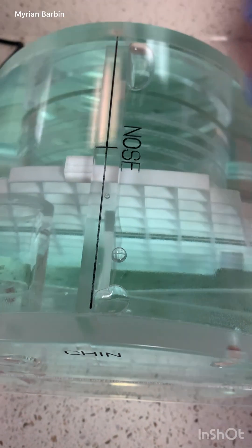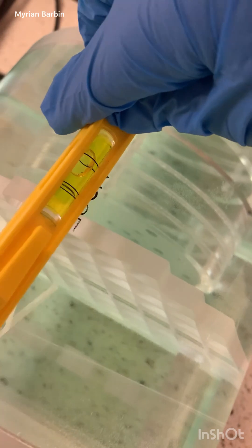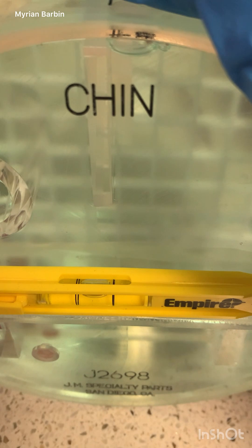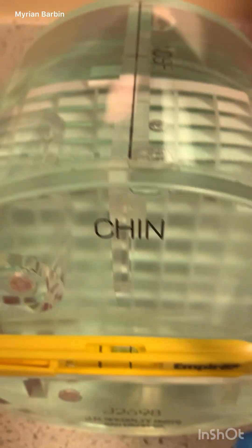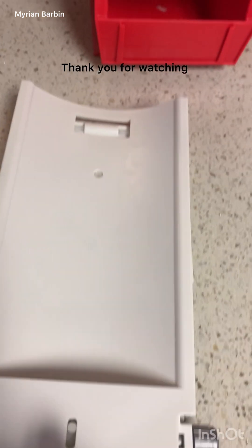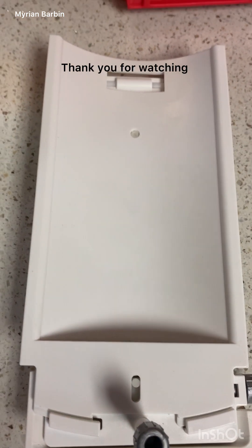Before you start, this is how you set it up: take your level and place it on the phantom right there. Make sure the bubble is in the middle and the phantom is level. Be careful not to let it roll off — you can use your hand to stabilize it while you check.